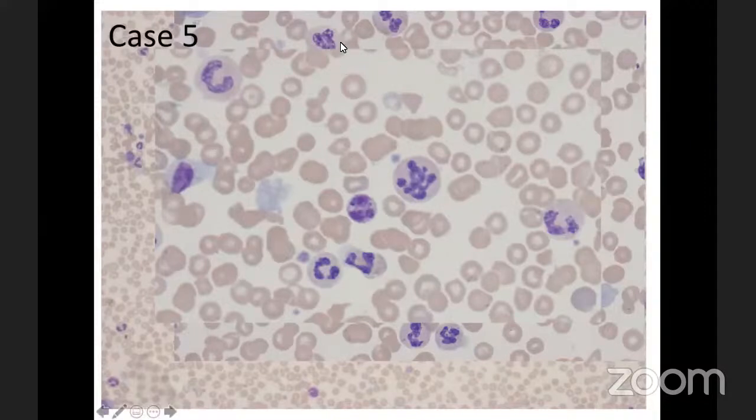So what do you think? What are we dealing with in this lady? Myeloid leukemoid reaction? With a leukemoid reaction you would have a reactive change. CML could be a good guess; you need to confirm it by FISH for BCR-ABL. MDS, no, they look very nice morphologically. MF, thank you. Yes, most likely this is an MF.